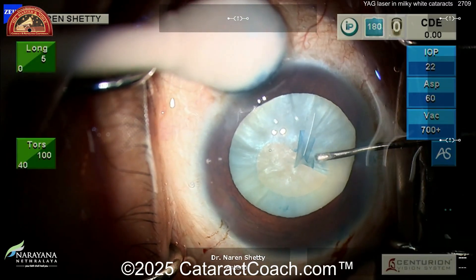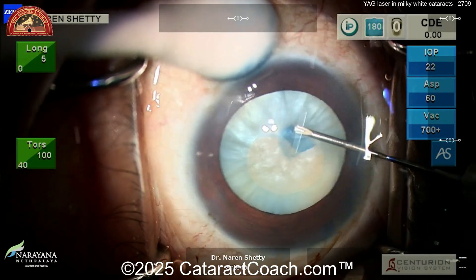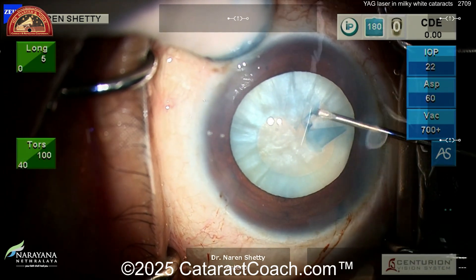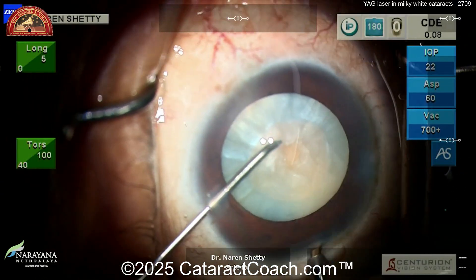This goes along with what we learned earlier from Dr. Panat Pang Puthipong. We did his podcast and had a video two weeks ago about the same kind of concept — maybe we should rethink the way we do these. In this case, you can see the risk of capsular runout or Argentinian flag sign is basically eliminated.